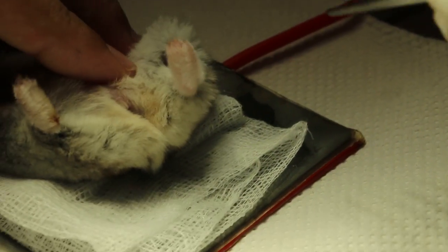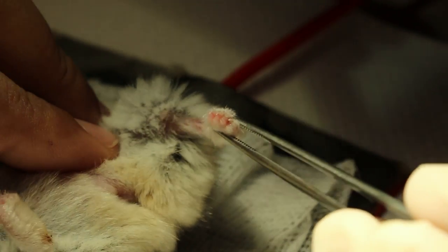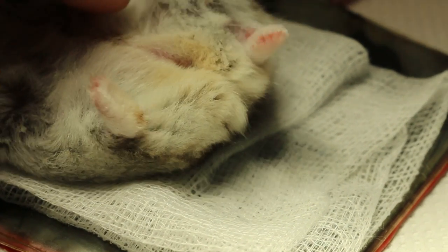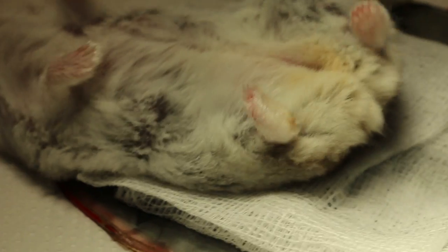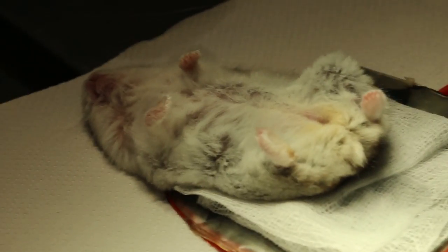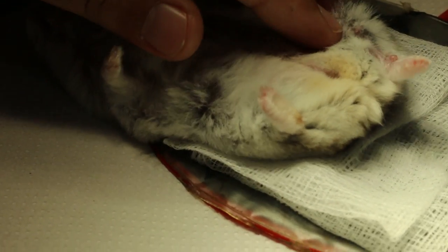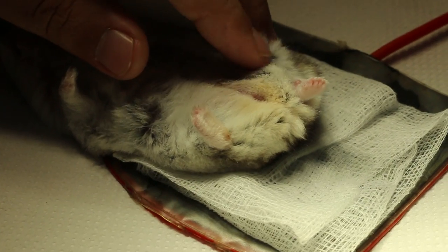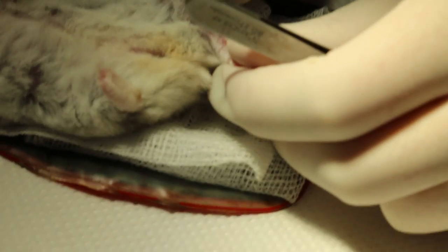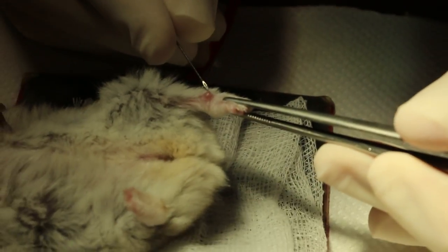Have a look. This one's small. A small one. Is it there? Is it abscess? Abscess, huh? Abscess can be lanced now. Zoletil plus isoflurane gas. No more already? That's oxygen. Yeah. We don't block the. Okay, no. It's abscess, so we lance it.